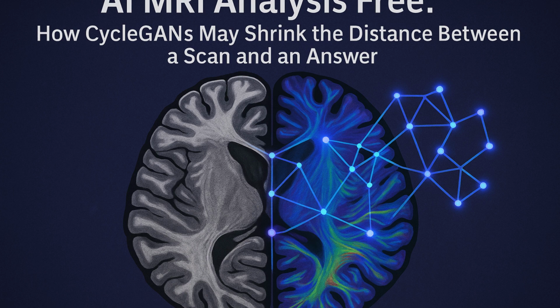Things like DeepBrainSeg, from MIT, actually. Ah, yes, I know that one. Free for research. Seems particularly good at generating masks around brain tumors. Right, segmentation. Useful for researchers needing quick tumor outlines, though it can need some serious computing power, like a good GPU. Good point. Then there's FastSurfer, also free, research-focused. FastSurfer is impressive. It does cortical parcellations, dividing the brain's surface into regions very quickly. And the developers seemed really active, supporting the community. That's a big plus for research tools. Active support makes a difference.